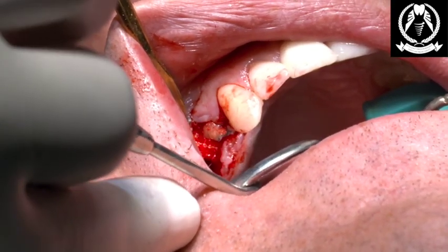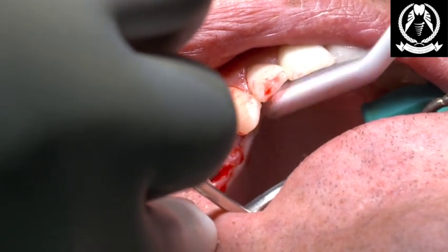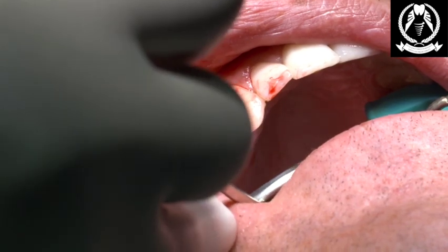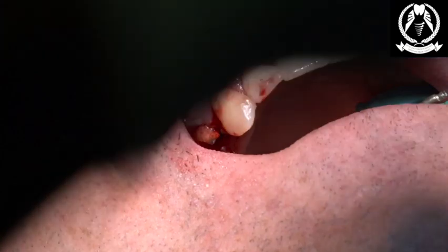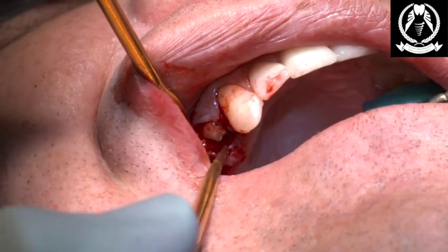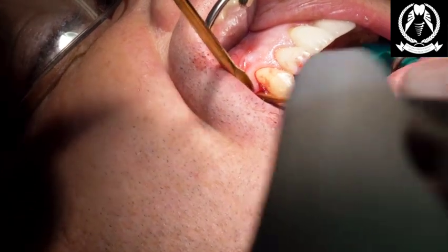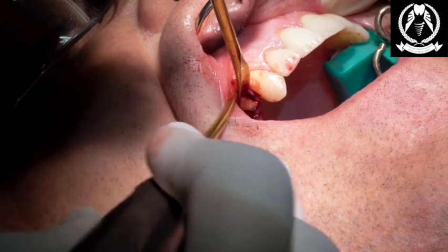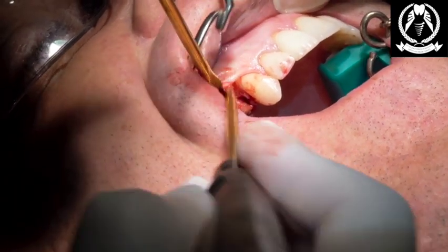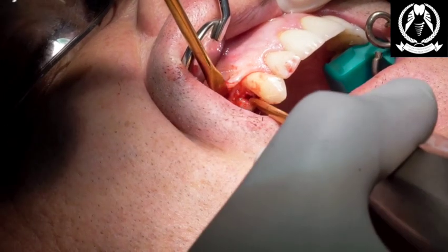Yeah, okay. I'm going to reflect a little bit on the palatal, Bianca. And yeah, so I'll just reflect with the other luxator there. See if this wants to play. Okay. Let's take that papillae there as well to see. I'm just gently elevating the wee flap. See if we've got any more movement.